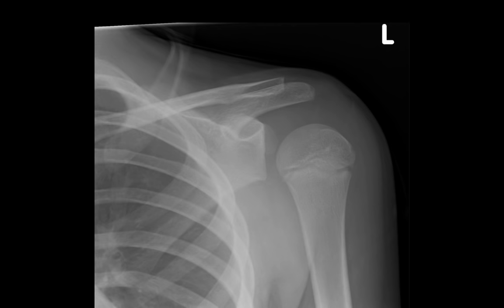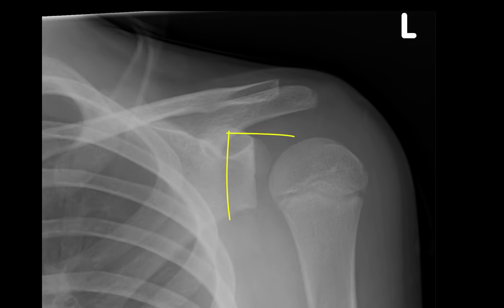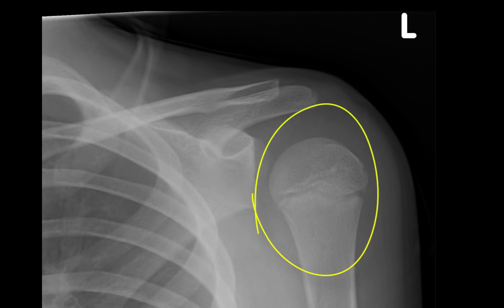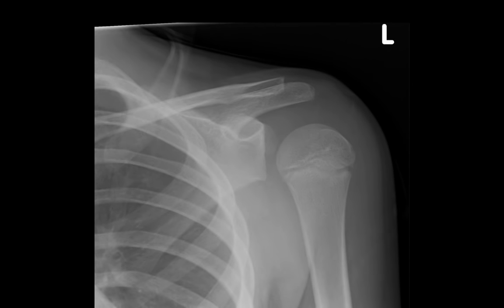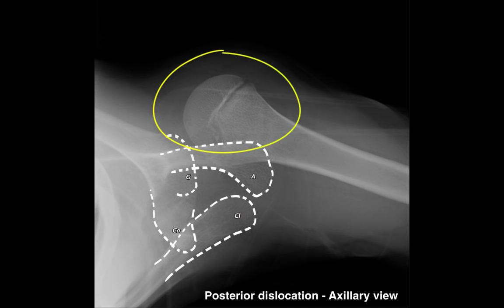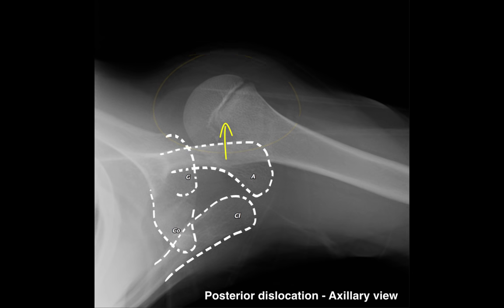What's the abnormality in this shoulder x-ray? In this particular case, there's some increased spacing between the humeral head and the glenoid fossa, but importantly the humeral head looks far more symmetrical than it should, appearing like a drumstick or a light bulb. This is the pathognomonic sign of a posterior dislocation, and we can confirm that with our lateral film, showing that the head of the humerus is indeed posterior to the acromion process and away from the chest wall.